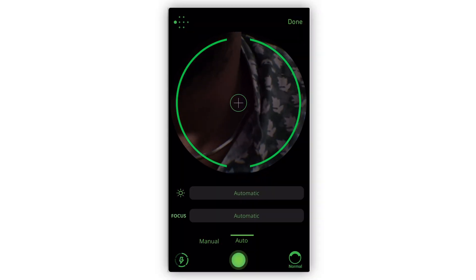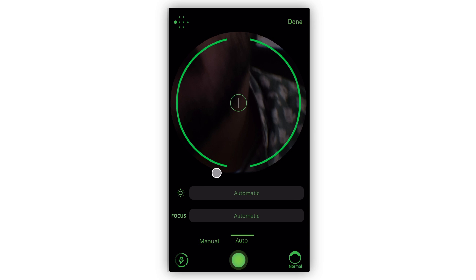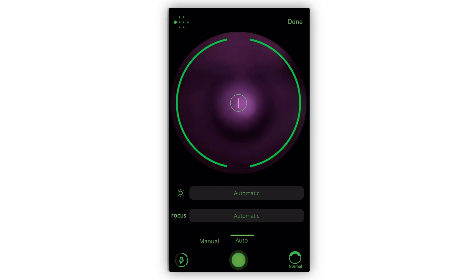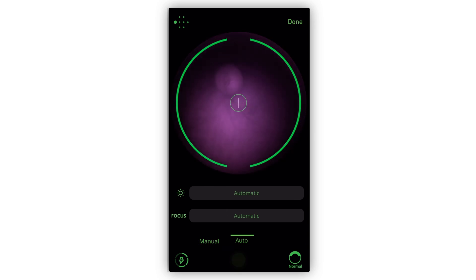The on-screen focus slider has a limited range. For more control, use the focus wheel. If you're in auto mode, tapping on the on-screen trigger will activate the auto mode analysis.